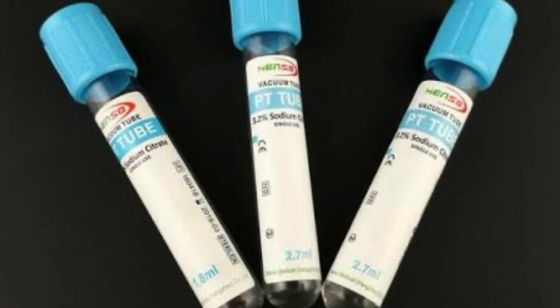Calcium is required for blood clotting. For the light blue top tube, we invert the tube 3 to 4 times. Why? Because it's for good mixing. It mixes the sodium citrate for accurate clotting tests.